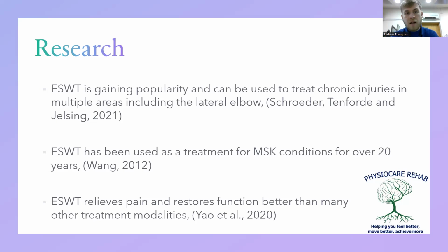It generally is, as I said early on, very non-invasive. Almost all people find it quite therapeutic and quite pleasant. The only real contraindications or things to be worried about are things like being allergic to the gel that you might use, because you have to use a lubricant on the surface. So it's just making sure that you're using one which works for you.